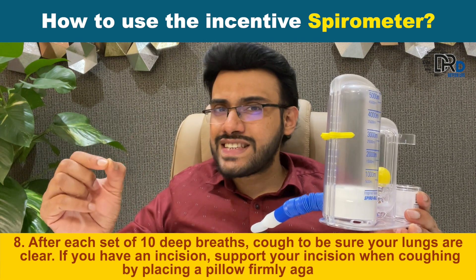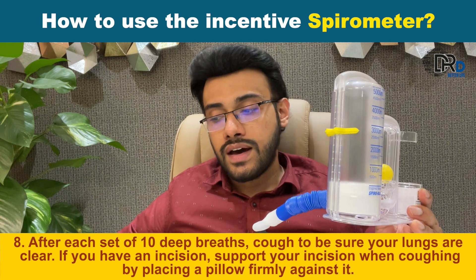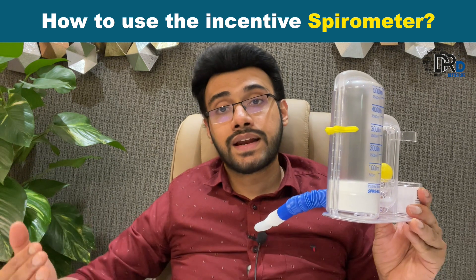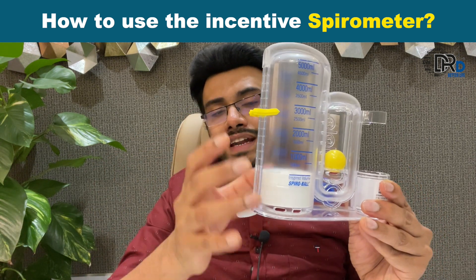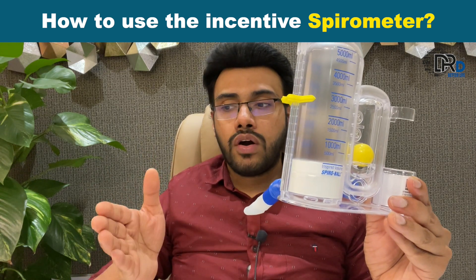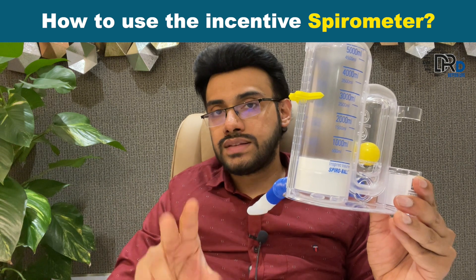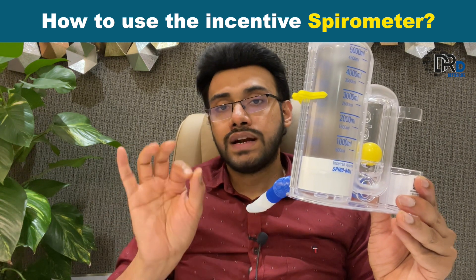If you have an incision in your abdomen, while you are coughing you can use a pillow for support. That is another way to prevent hernia. This device you can use four times in a day — before food three times and just before sleep one time. So four times, ten sets each.